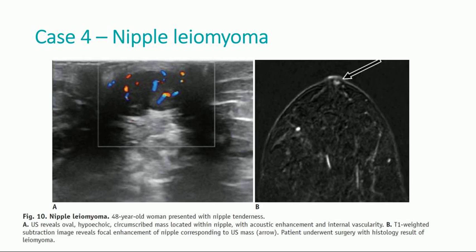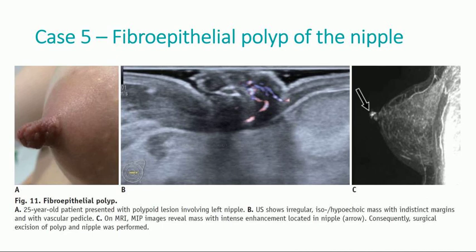Some rare benign nipple tumors. Case number four: a nipple leiomyoma in a patient that presented with nipple tenderness. The ultrasound reveals an oval hypoechoic circumscribed mass located within the nipple with acoustic enhancement and internal vascularity. The mass was also depicted on the MRI as a focus of enhancement. A fibroepithelial polyp of the nipple presented in a 25-year-old patient. Ultrasound shows the mass with the vascular pedicle and intense enhancement on MRI.